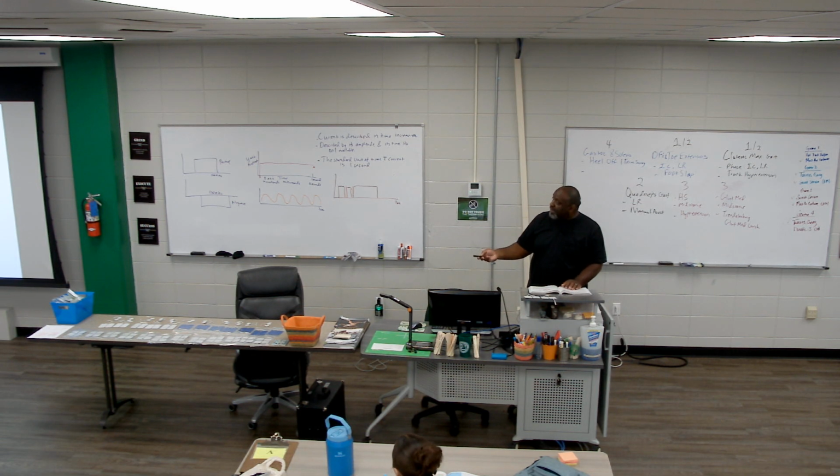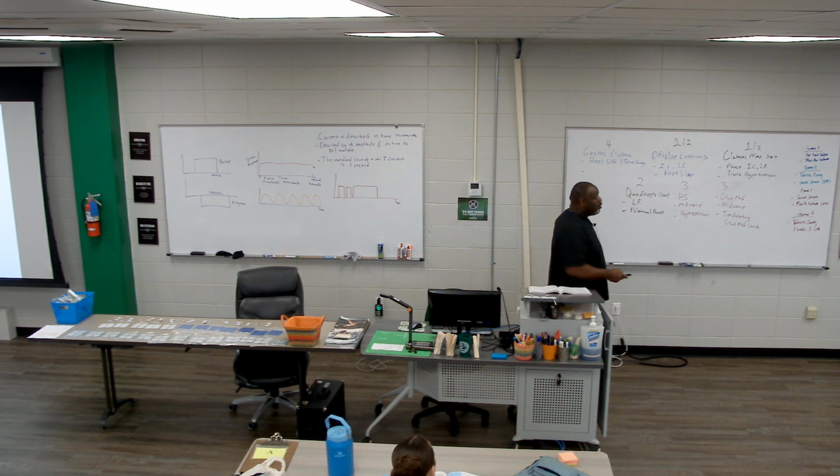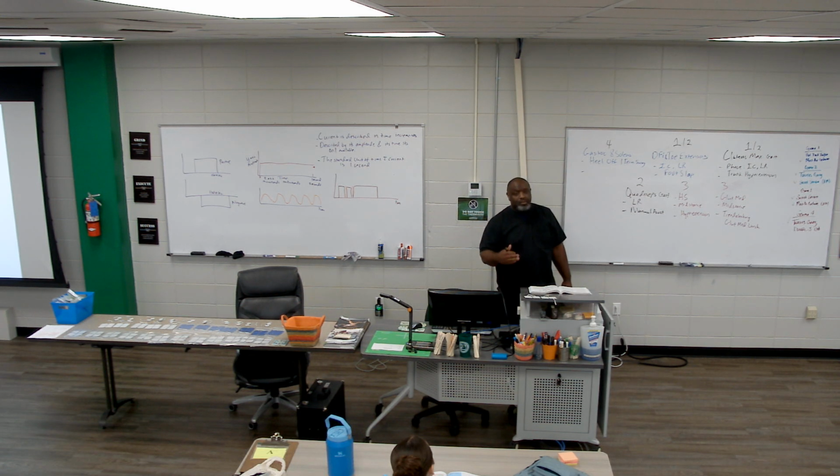That's biphasic symmetrical. The phases will match. So this phase matches this phase. The only difference is one is above the isoelectric line, one is below the isoelectric line. Above, below. But the design matches specifically. So that's symmetrical biphasic.